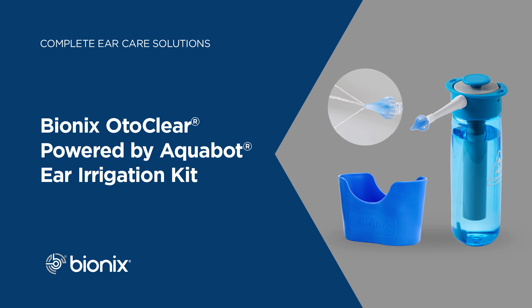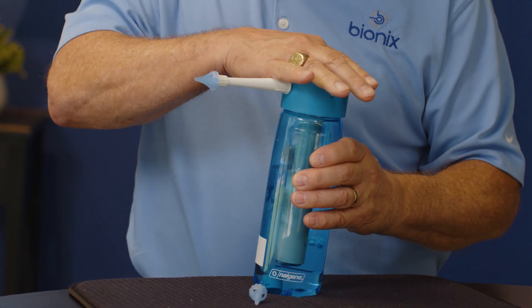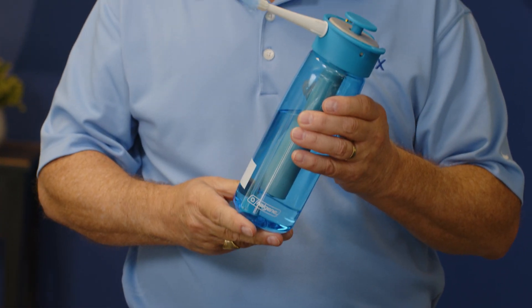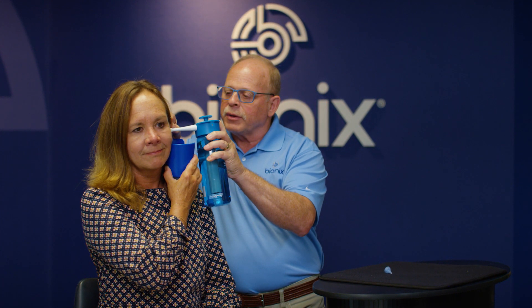My favorite is the Aquabot. The Aquabot provides a steady stream of pressurized water to effectively flush wax from the ear canal. All you do is simply fill it with water, pump it up to pressurize the canister, and fully insert it into the ear canal. We're going to let her hold the basin, then depress the plunger to allow water to flow into the ear canal. No pumping, no squeezing is required.